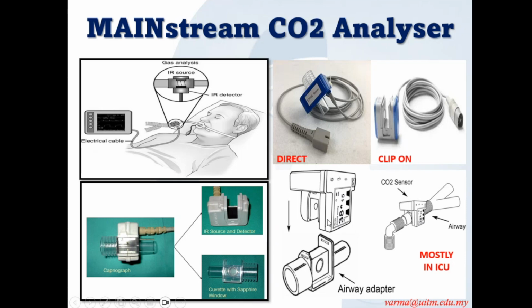This is the adapter, and you will put on a clip-on type of CO2 analyzer, which is used in some ICUs and HDU, or in the district, I have this portable one. We have used this where it shows your ETCO2 and waveform here, or it is connected like this and it's connected to the main monitor where your ETCO2 and Capno comes out. Okay, this is your Capnograph.